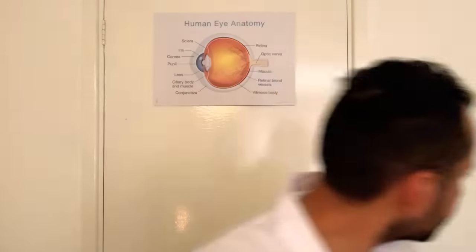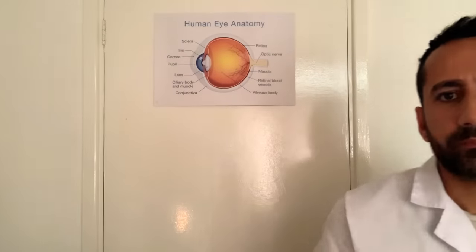Okay, let's perform some right eye ophthalmoscopy. Okay, just looking straight ahead, we'll start with the external zone. That's good. Look up, look to the right and to the left, and looking down. Excellent. Now looking straight ahead. Good. Okay.